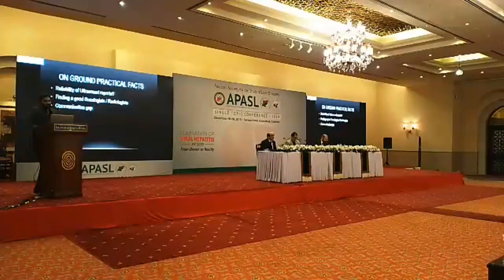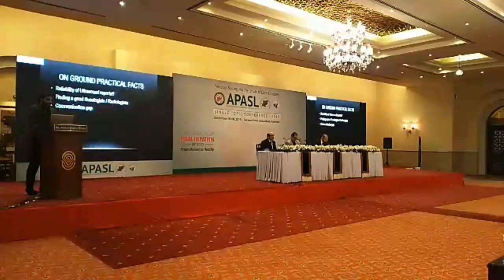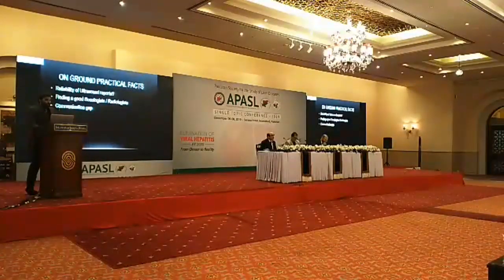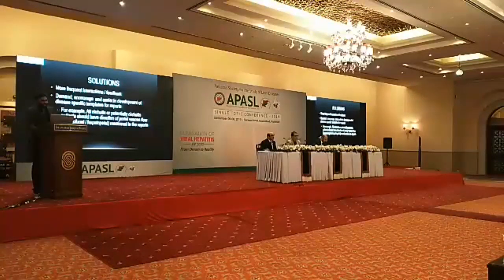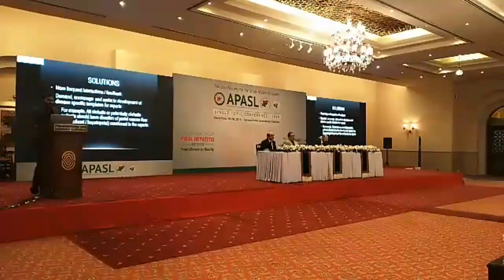So what happens on the ground is, as mentioned before, that the reliability of ultrasound reports in general is pretty questionable. There are few people who do it in the right way, few people who have the right equipment, and there is a communication gap between the ordering physicians and the radiologists. What are the solutions that we should be looking into, because ultrasound is an extremely important modality for surveillance, and there is a huge gap in this field.